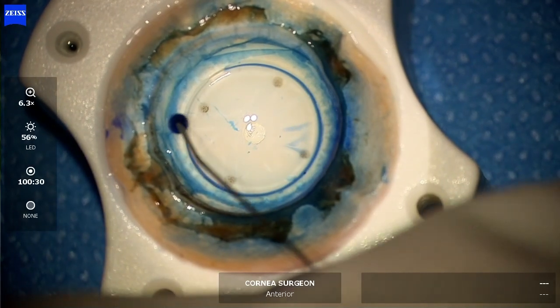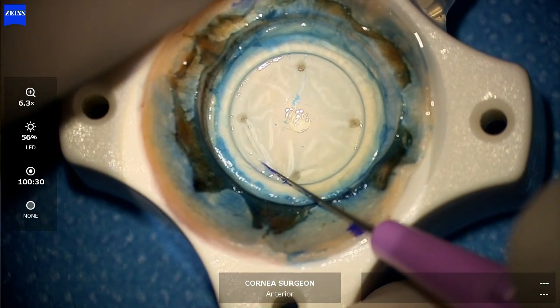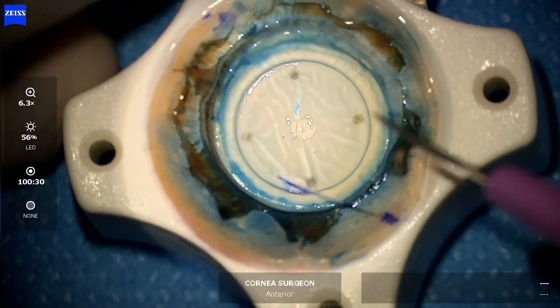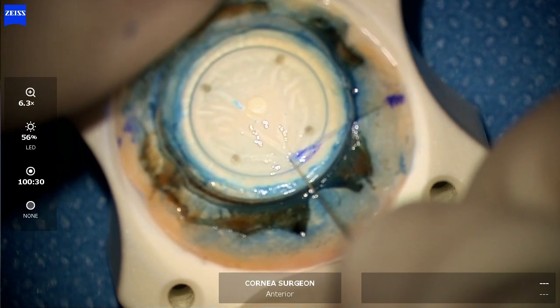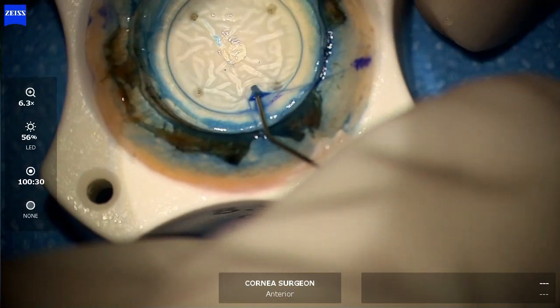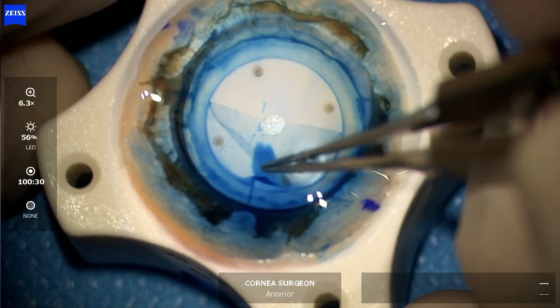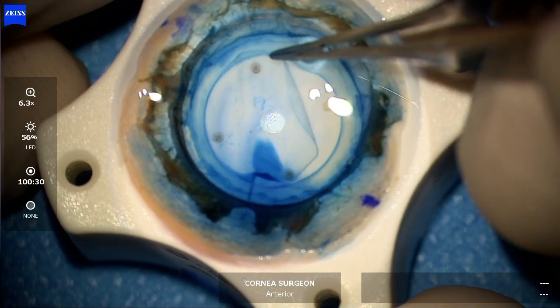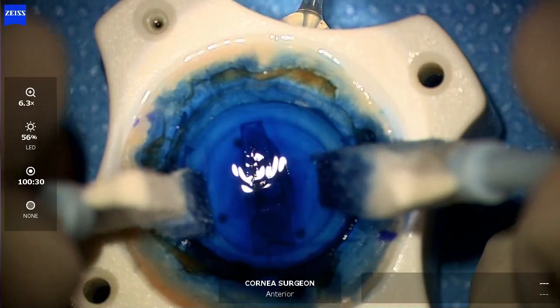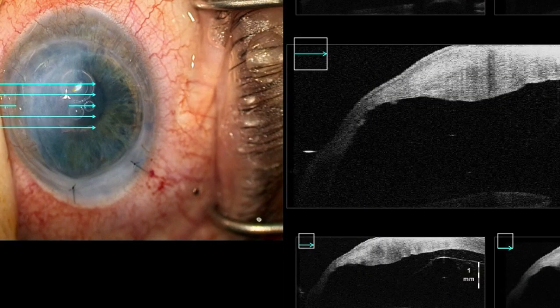The edge of the graft is then cut with a long and a short perpendicular, making it look like a seven, and that extra piece of tissue is removed. When the graft is inserted into the eye in the correct orientation — endothelial side down and stromal or Descemet side up — it would then look like a reverse seven.